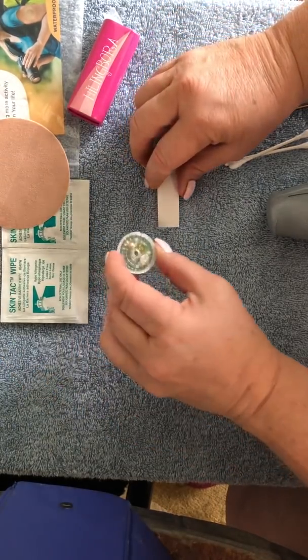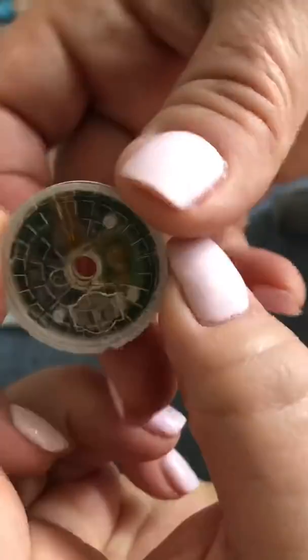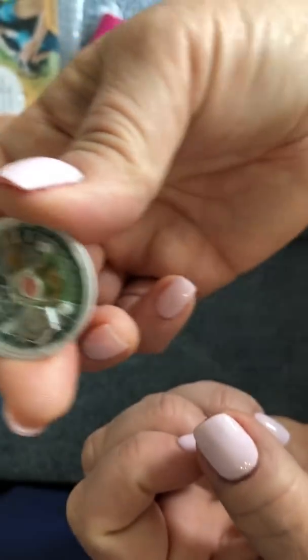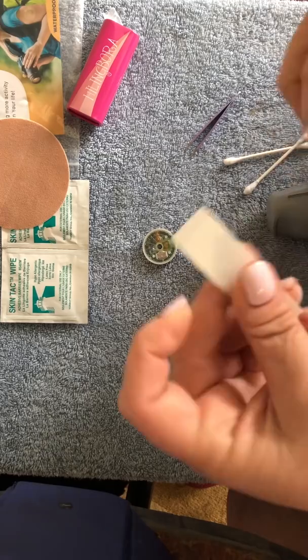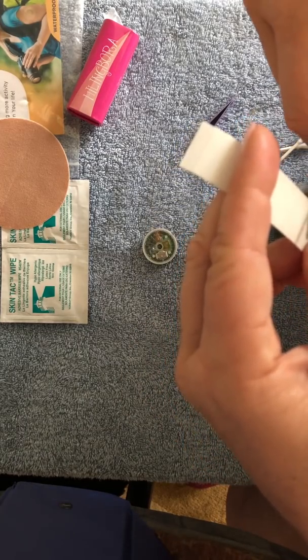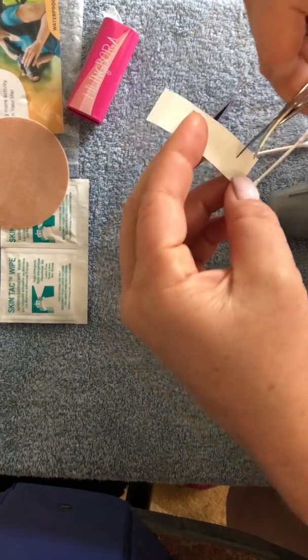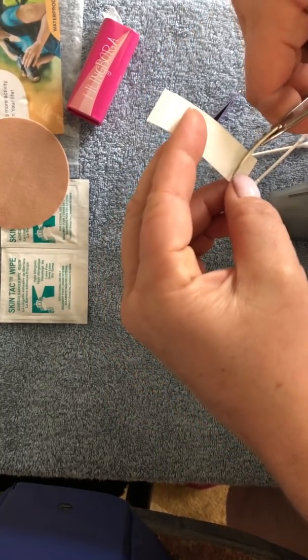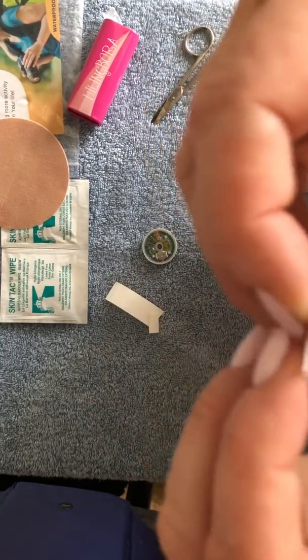So what I do is I take the sensor, and again, notice you've got your little triangle there. I'll put it up closer, sorry. So you got your little triangle there. What I do is I'm gonna take some of this fashion tape and I'm gonna cut it, okay? So I'm gonna do 2 strips of it. So there's 1, and there's 2, okay? So this is where it gets challenging because double-sided tape is a pain to work with.